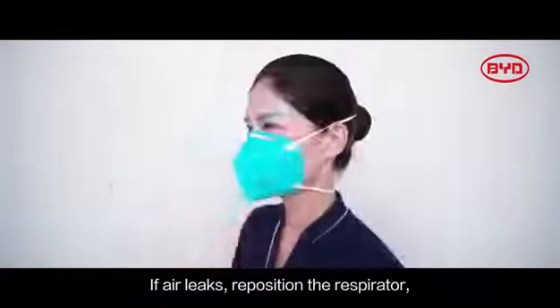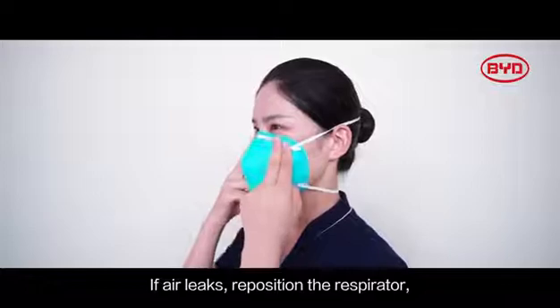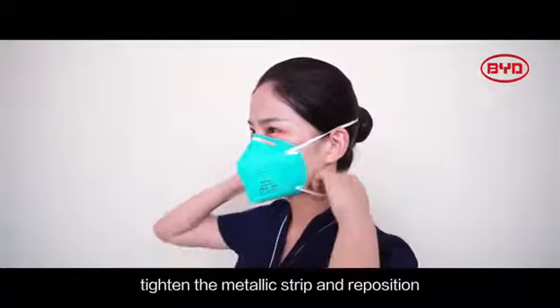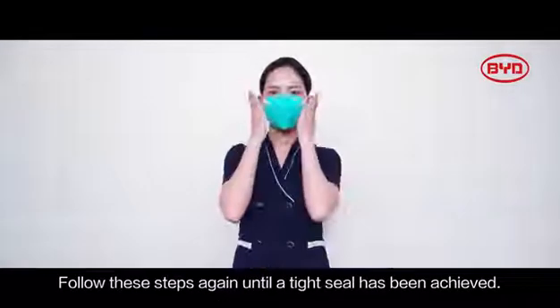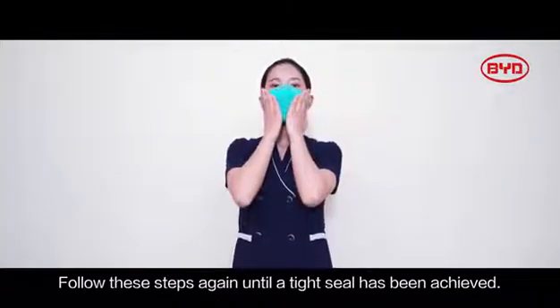If air leaks, reposition the respirator. Tighten the metallic strip and reposition the elastic bands for a better fit. Follow these steps again until a tight seal has been achieved.